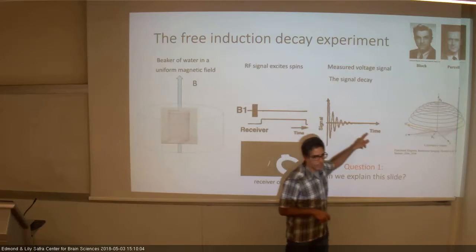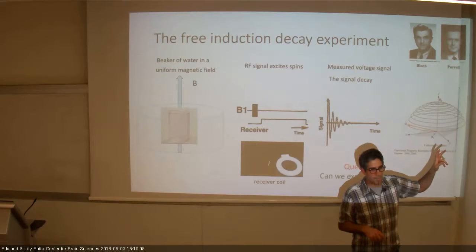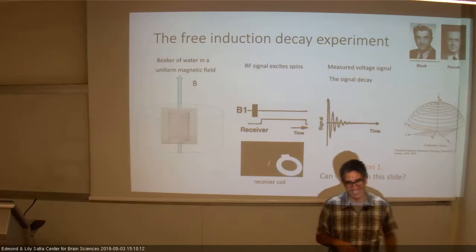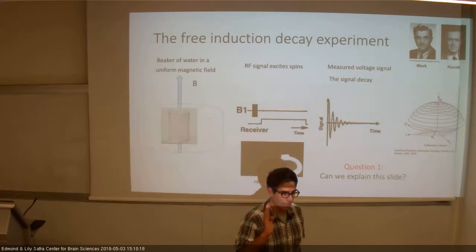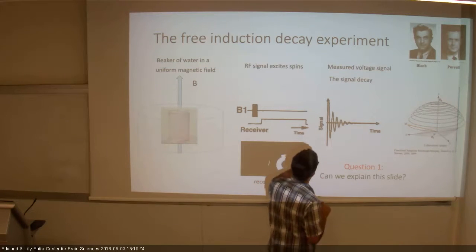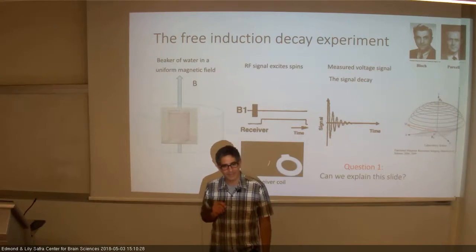But then we also see another thing. Who wants to explain that? Should I choose again? We see a decay in the signal as the magnetic field returns to its previous state. Okay. So as the magnetic vector, not the magnetic field, is going back, what do you think is going on in here? It's moving closer.